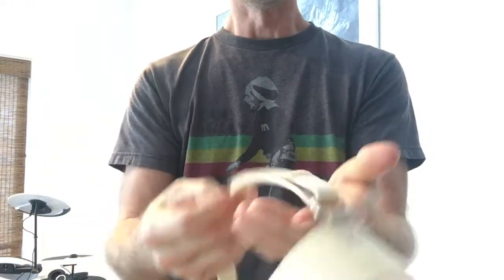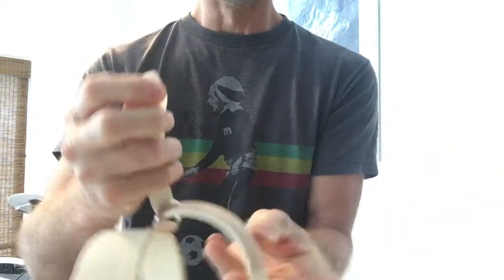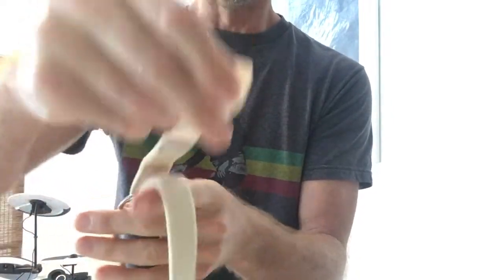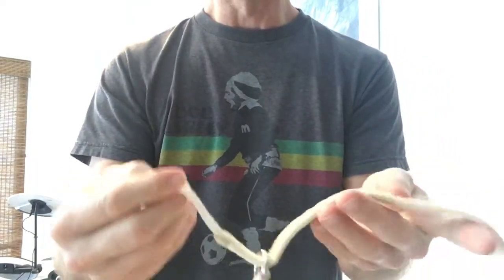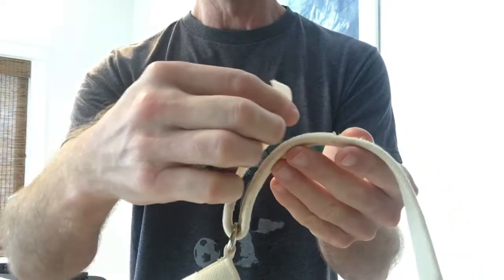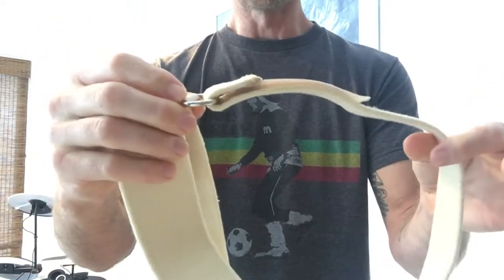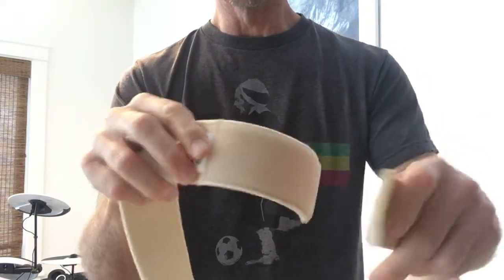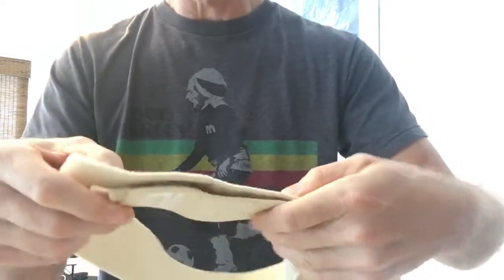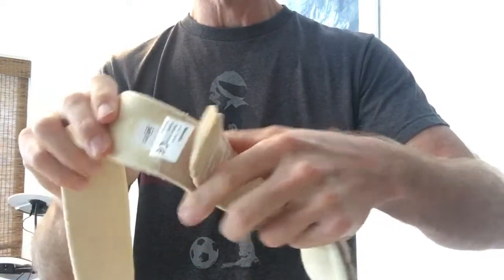This big thick leg strap also doesn't really give you that much adjustment because you only have this amount of Velcro. If you've got to tighten it up and pull it through, now you have no adjustment there because you're past the loop side of the Velcro. That's the only place you can put the leg strap to make it tight, so if that's not tight enough for you, you're kind of out of luck. The same thing goes for the waist strap — you only have this amount of adjustment, and if you want to tighten it up during something strenuous, you've got nowhere to go other than that one spot where the Velcro hits.